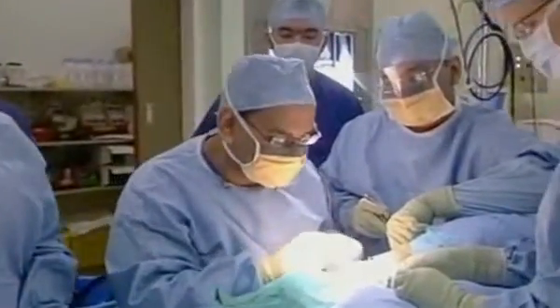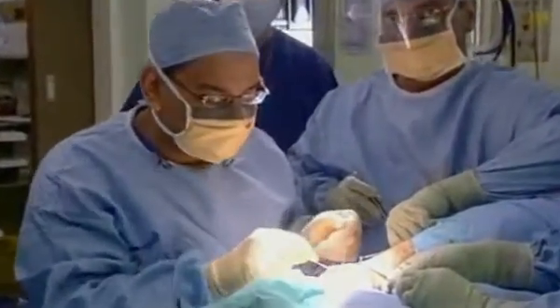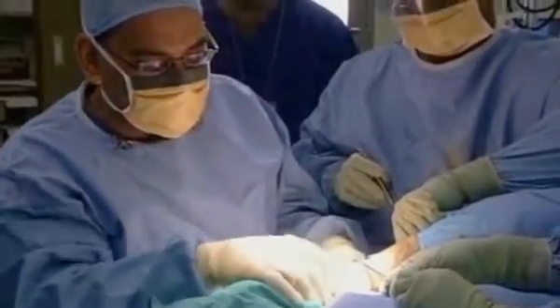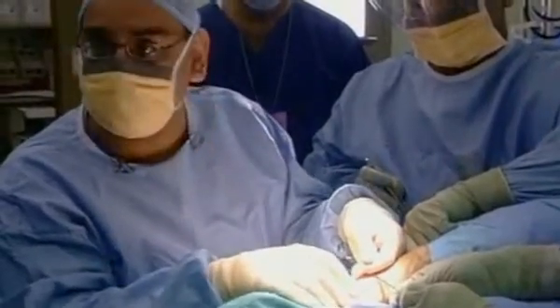OK, so these are the tendons. The 2 tendons, peroneus brevis and peroneus longus. One of them is flat, and what we've found is that these are the tendons. Now, normally, they sit behind in the groove there in most people. What's happened here, his tendons are jumping forward and sitting there.